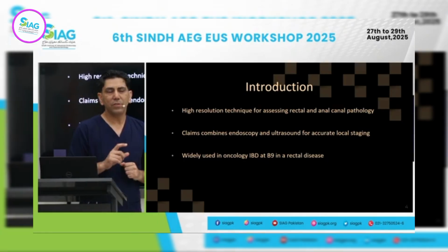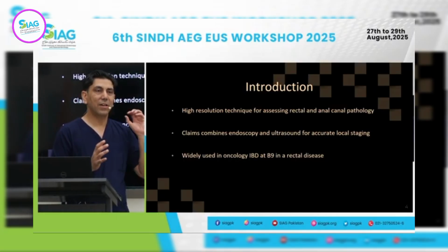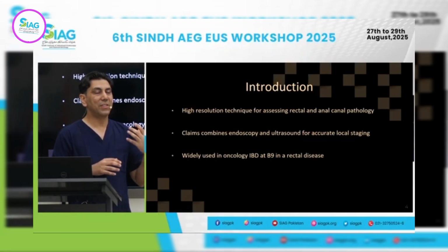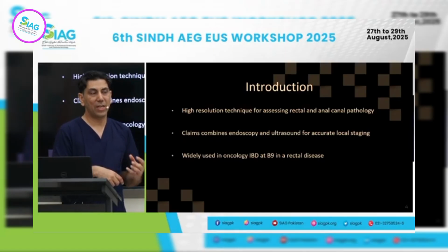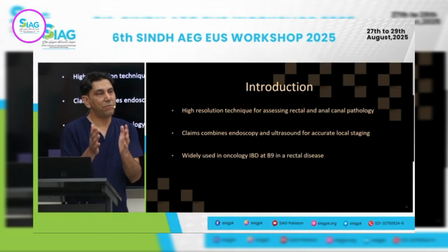Now, one of the areas where we've seen a lot of expansion is EUS in inflammatory bowel disease. We've also had patients who presented with cecal lesions where the endoscopist had to use a thin probe through the colonoscopic channel to visualize it. So there is an evolving field out there.